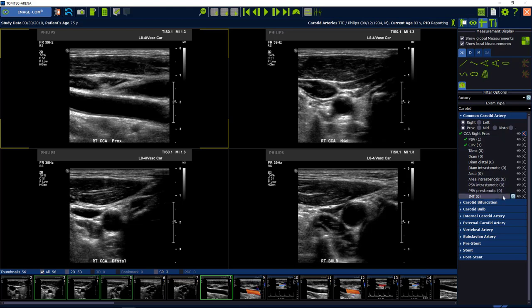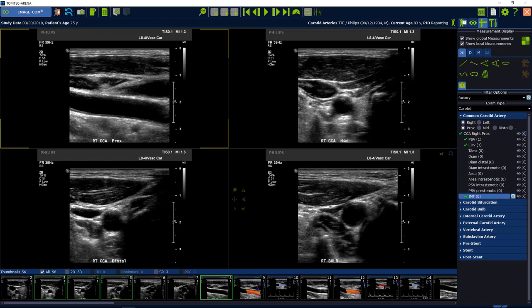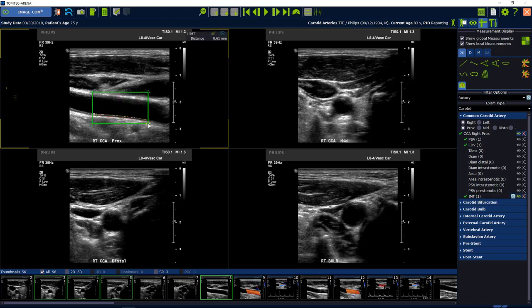Then the package is open. Here you see IMT and you start the analysis with the automatic detection button. In the next step a measurement window has to be drawn with two left clicks. The red line defines the minimum size of the box.